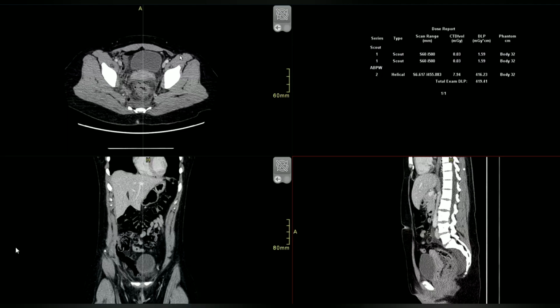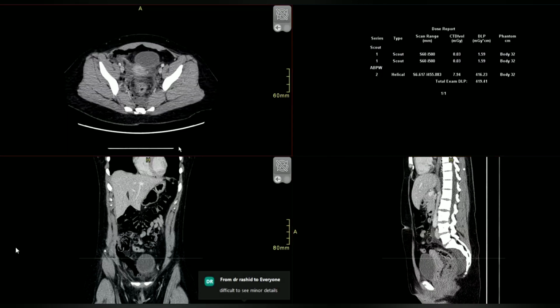So, what do you want to do next for this patient? I would also like to review the bone window images. No, we can leave that, because she didn't have any trauma to the bones. There wasn't any. So I just said, what do you want to do next? She needs immediate surgical referral. Okay. Surgical consult. Okay. Yeah.